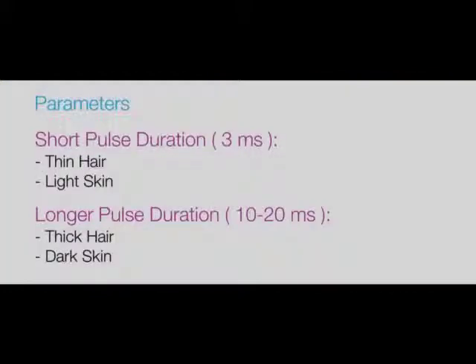Extended pulse durations can also provide increased safety for darker skin types. Remember, with darker skin types especially, test spots are highly recommended.